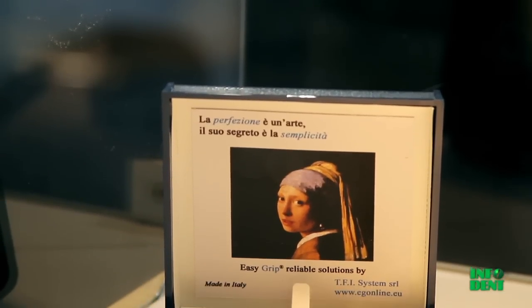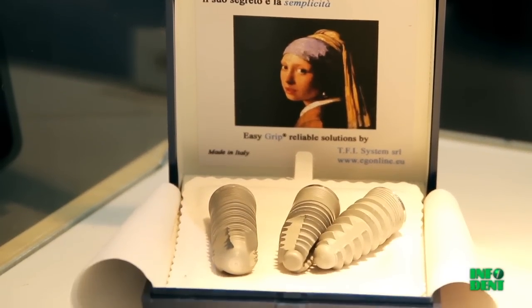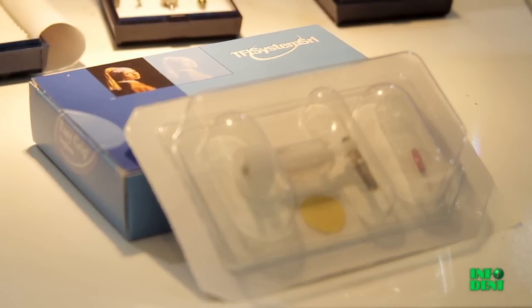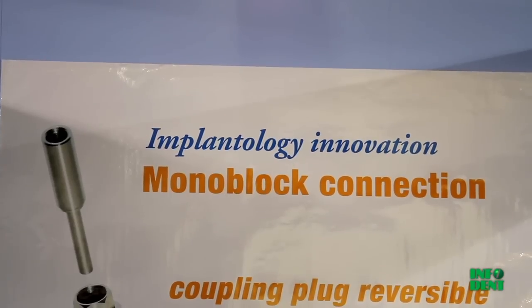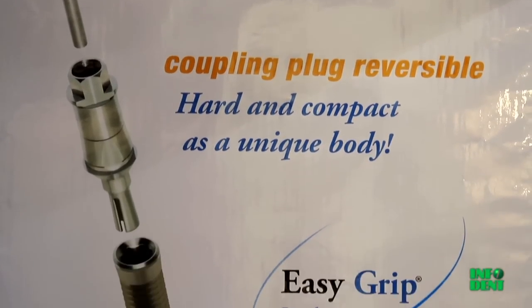Quality, simplicity, and innovation — these are the guidelines that motivate our company, and that are the basis for the manufacture of all EasyGrip implants. Distribution in Italy has been entrusted exclusively to Umbra S.P.A.